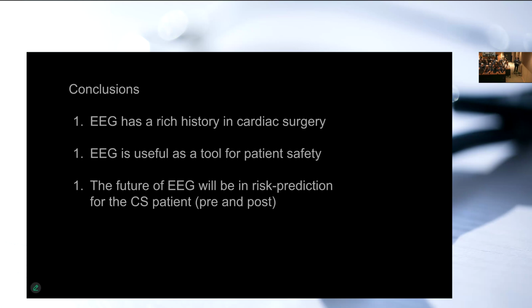Thank you. No, that is the question, right? For everyone else who's not in anesthesia, you can produce burst suppression in every brain at some dose of a GABAergic drug. It's hard in children, but you can get there. In every adult, we do produce burst suppression in almost everyone to a small degree, but it doesn't have that robust signal of harm in everyone. So it's the fact that at a very low anesthetic administration, they are so apt to produce burst suppression that is the marker of the cellular dysfunction at the seat of their cognitive issues.